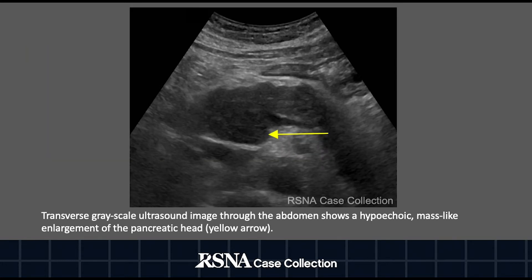Transverse grayscale ultrasound image through the abdomen shows a hypoechoic, mass-like enlargement of the pancreatic head, denoted by the yellow arrow.